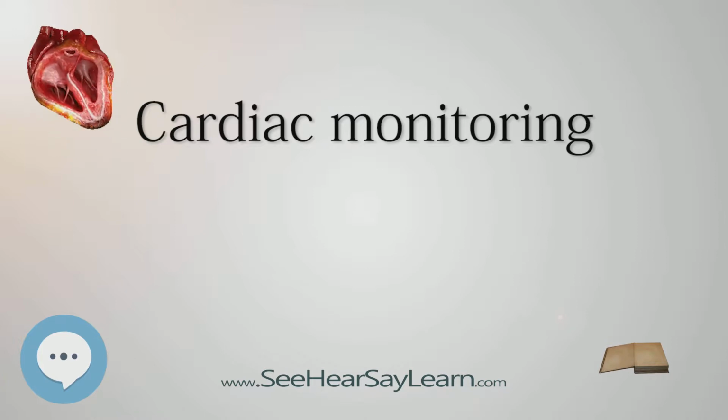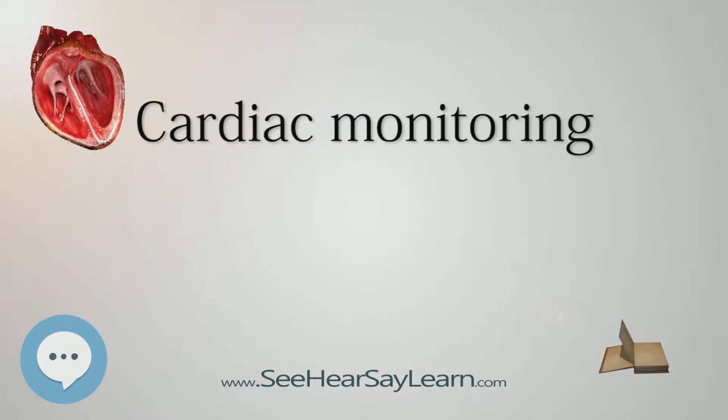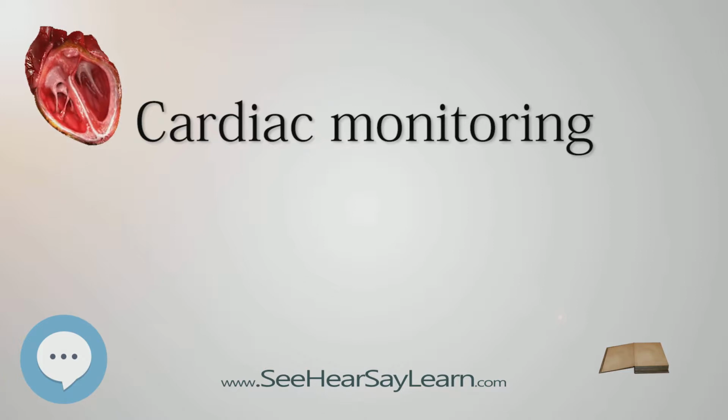Emergency medical services. In the setting of out-of-hospital acute medical care, ambulance services and other emergency medical services providers utilize heart monitors to assess the patient's cardiac rhythm. Providers licensed or certified at the intermediate or paramedic level are qualified to interpret ECGs. The finding of a cardiac dysrhythmia, or for that matter, a normal sinus rhythm, may give additional information about the patient's condition or may be a sufficient diagnosis on its own to guide treatment.